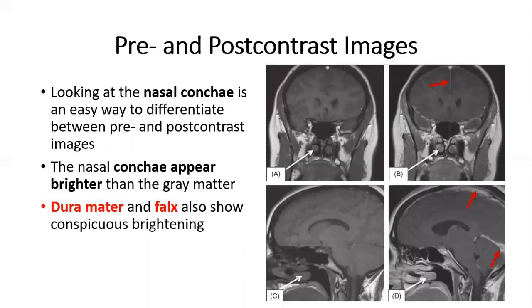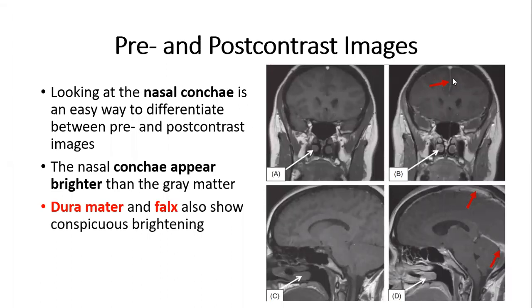Something important — we should know about the pre- and post-contrast images, how to differentiate between them. The contrast will be in the T1-weighted image, and it is quite simple. This is the coronal image. We should differentiate the nasal concha. In the pre-contrast image it will be dark, just like the gray matter. After contrast with gadolinium, it will be bright, brighter than the gray matter. Also, this is the dura mater and the falx cerebri, which will be bright after injecting the contrast material.